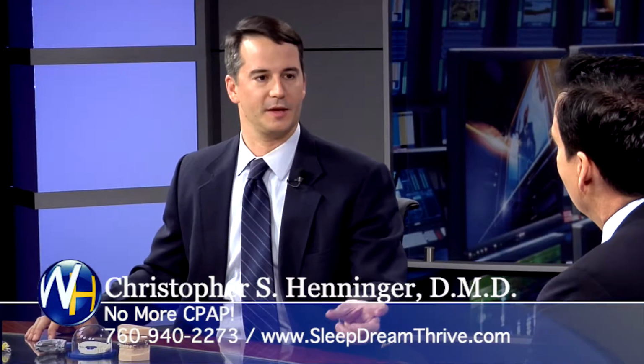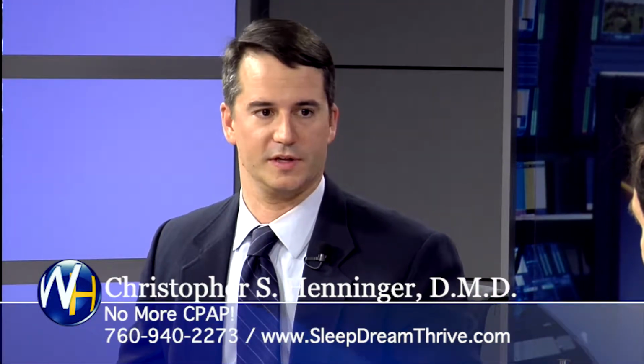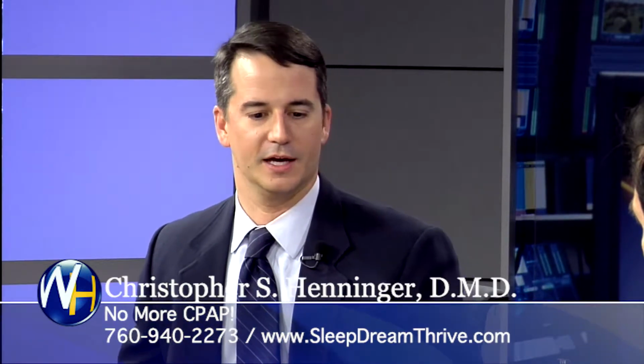You make the appliance. Do you do a comparative study? Correct. When we fit them with the device, they wear it for a month, sometimes 2, to make sure that they can tolerate it and it accommodates to their sleeping habits. And once they've been successful wearing it for 2 months, we titrate it. So we can advance their lower jaw forward more so that they can sleep better. And then we retest them with the home sleep test again. So Candy's number from 30 went down to 3, which is within the normal limits. So under 5 is normal. And so we got her down from having severe sleep apnea to having no sleep apnea.